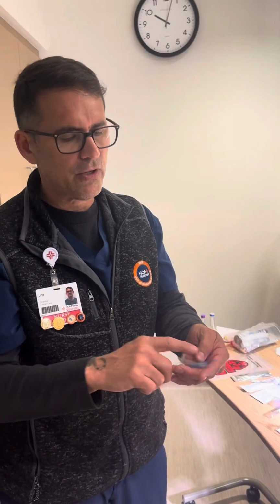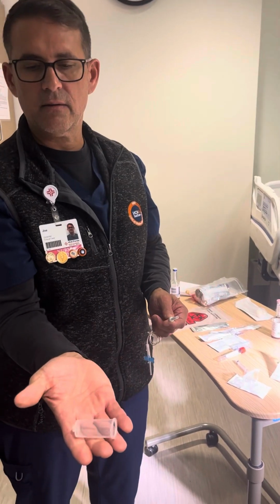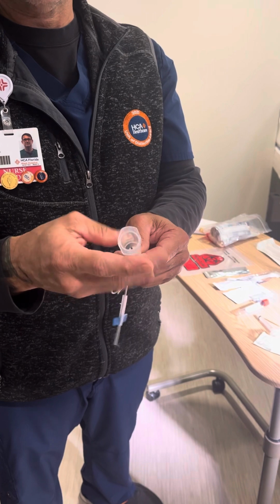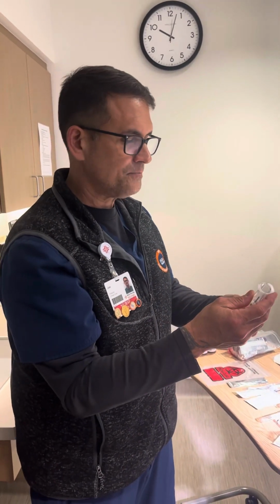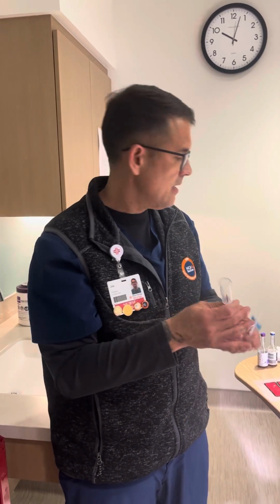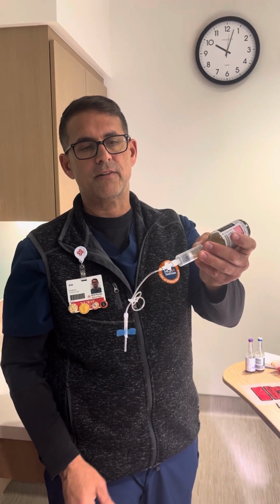Now, if it's a bigger vein and you're using a bigger butterfly, you can hook it up directly to that connector. And actually, you wouldn't be using this one. You would be using these right here, that don't have anything on there. So these just go right over this little thing, like that. And now you have basically the same as that, okay? I'll make sure that we have these on the floor because I'm not sure if we do right now. These are really good for bigger kids or kids with really good veins to draw anything, but also to draw blood cultures, okay? Because this little top goes right in here and you can get all your blood culture blood right from there.